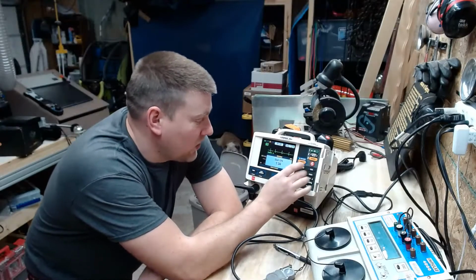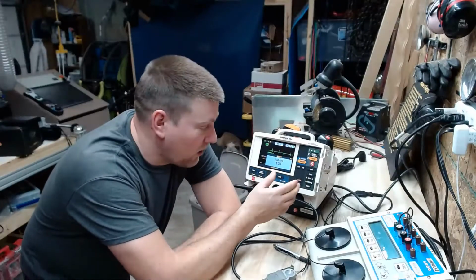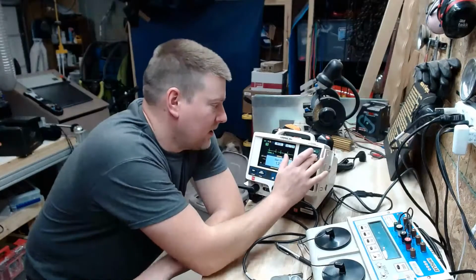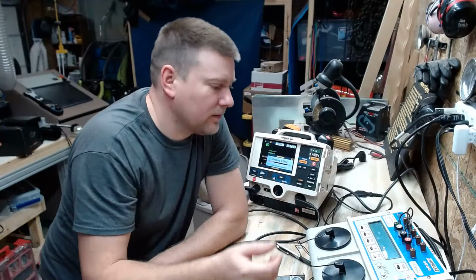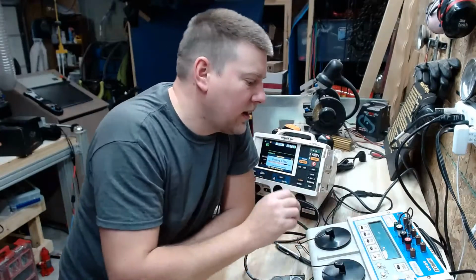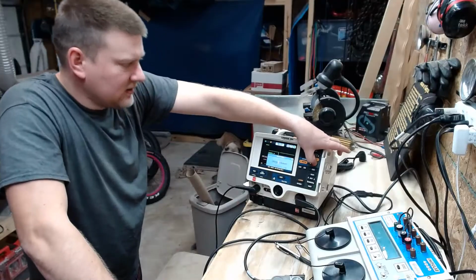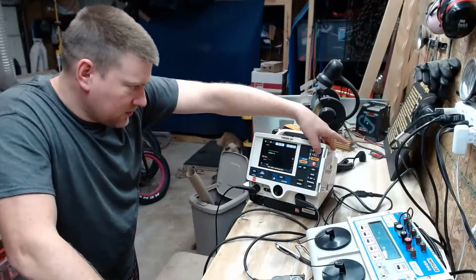One of the next things that we are going to check is we do like 10 to 12 discharges at maximum energy to make sure that the battery can handle it. So we just take it all the way back up. Energy high. Okay. Again, you got to make sure that it charges in less than 9 seconds. 3, 2, 1. 373 joules.